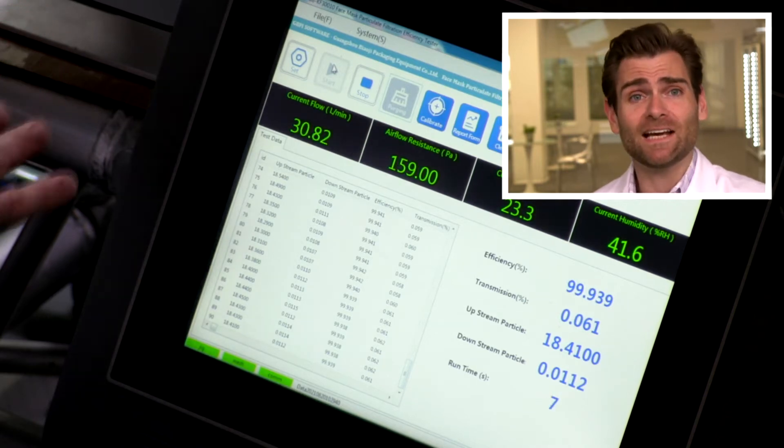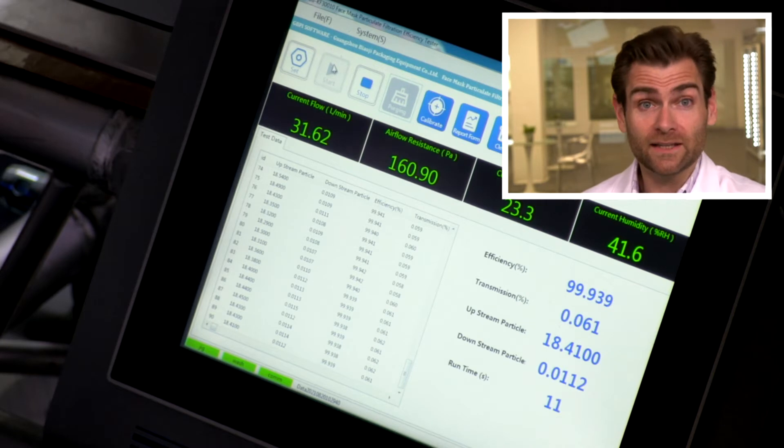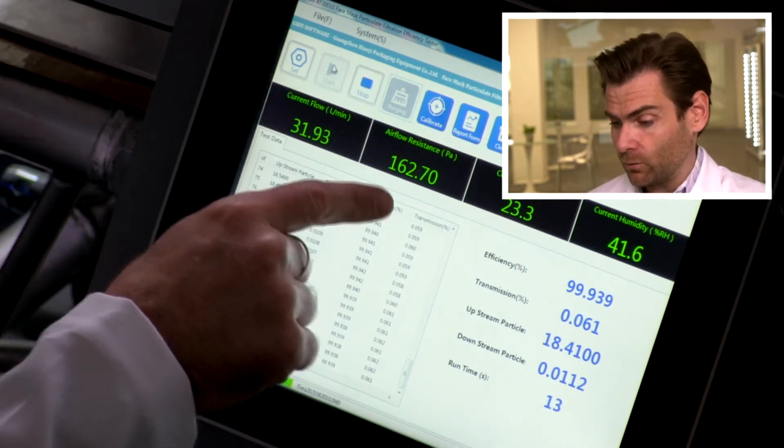This is a PFE machine — particulate filtration efficiency machine. We're doing it a little differently than we do a surgical mask: we're using NaCl instead of latex particles. If you want to find out more, I'll put a link there about the different setup. Right away I'm seeing that the breathability is super high — for most KN95s it's already at 164.